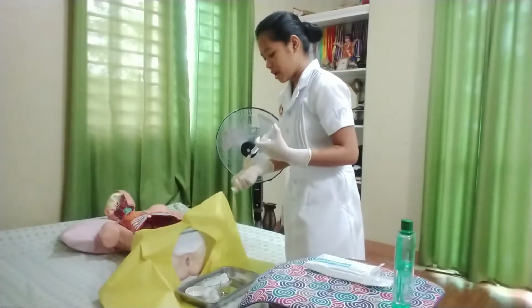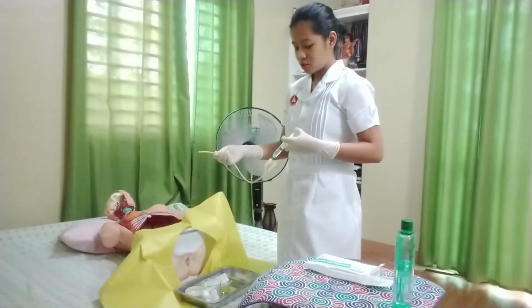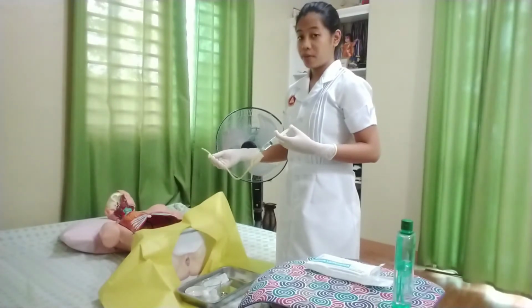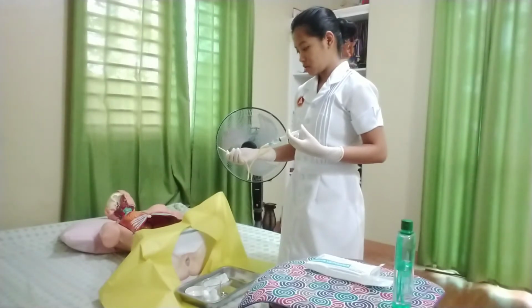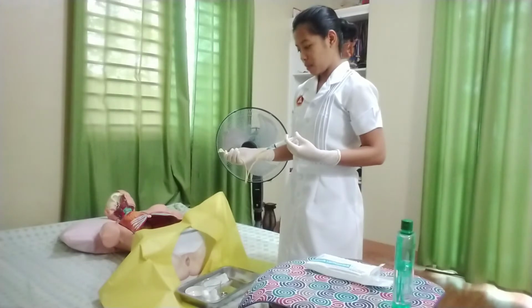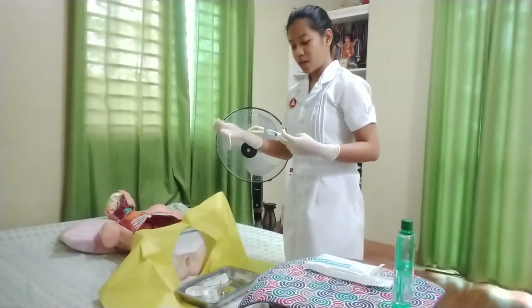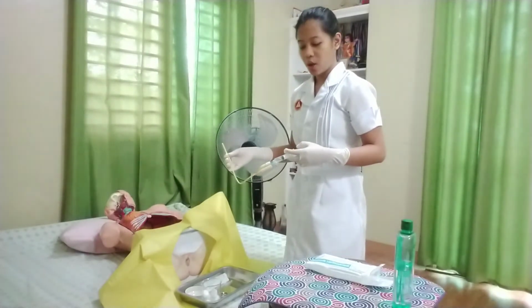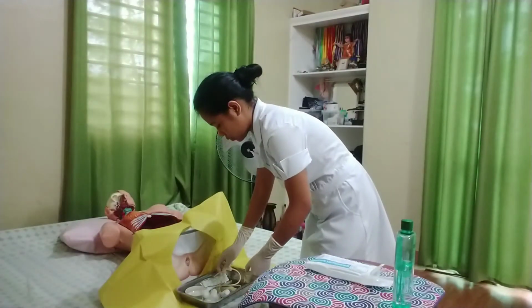And we will run a small amount of the solution to check if the balloon is inflating properly. So it's inflating properly. If it inflates properly, then we will withdraw the solution and leave the syringe attached to the injection port so it is ready.